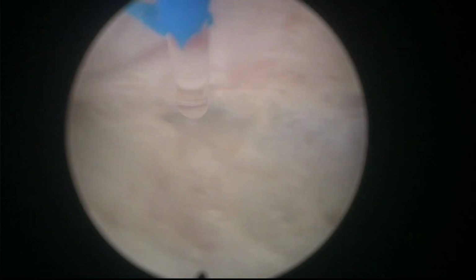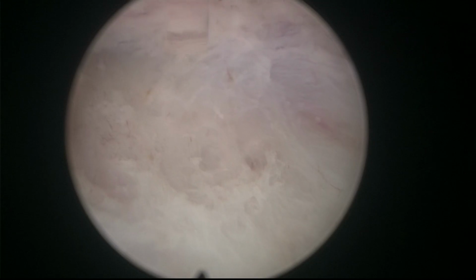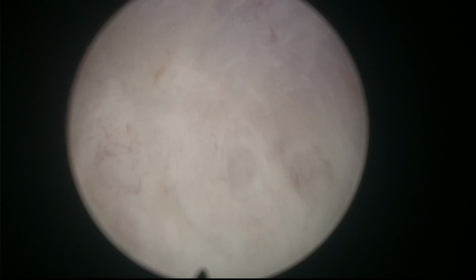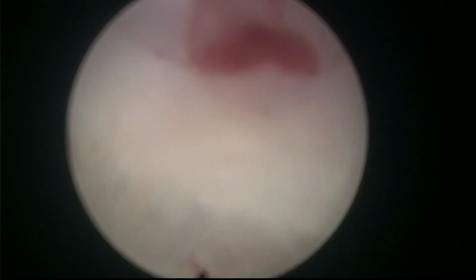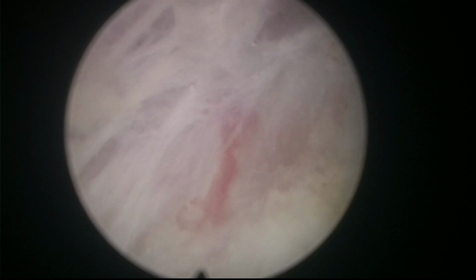When you're going to dissect, you have the line of attack, you have the adenoma, you have the capsule. So how can you dissect this plane? Well, one thing is, if you have to push, you shouldn't be pushing here, for example, because it's not mechanically clever, it's not going to work. But if you put the upper part of the scope there, you contact the capsule and then you slide the scope, you will be able to dissect a little bit better, although sometimes mechanical dissection has its trouble. Let's try it here. So here I am, you see, putting the tip of the scope a little bit downwards so I can push more efficiently.